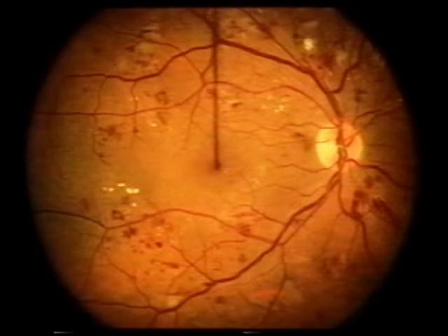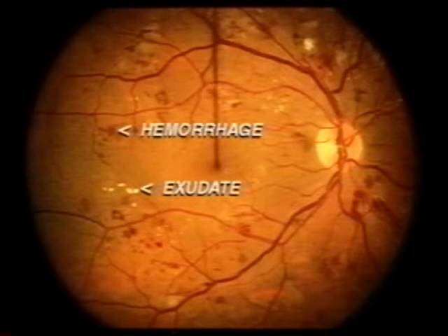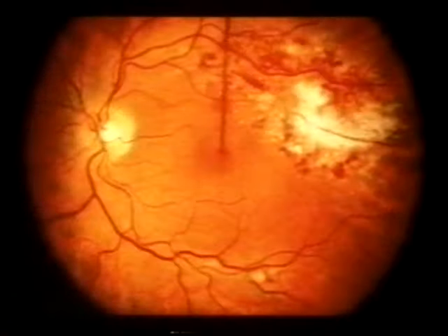This patient has small hemorrhages and exudates in the retina. Exudates are collections of fatty material that result from leaking blood vessels. This patient has a retinal infection caused by a virus that is associated with AIDS. This requires treatment with intravenous medications to prevent the rapid onset of blindness.